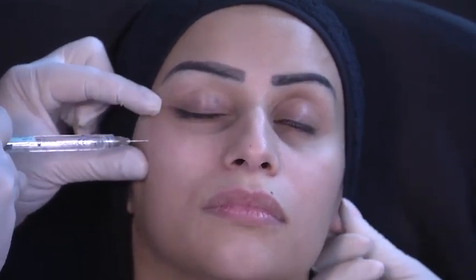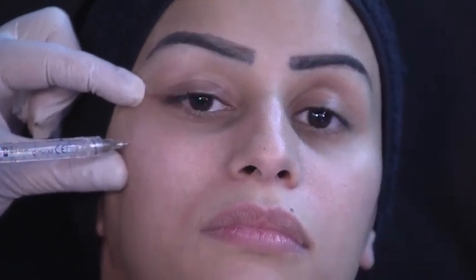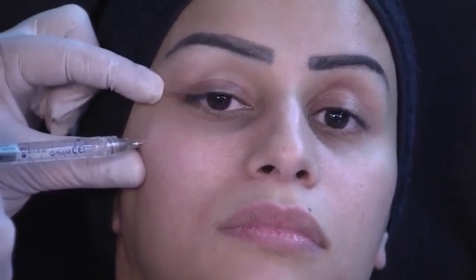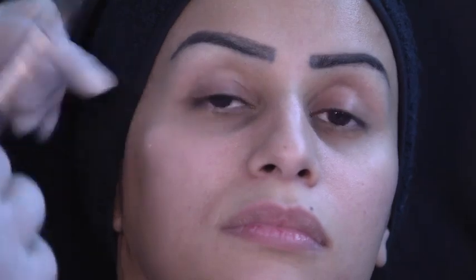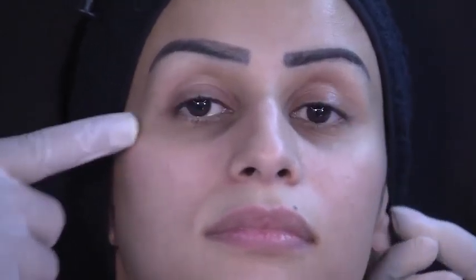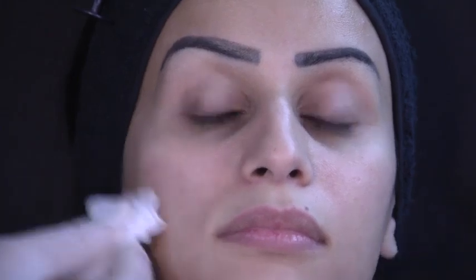So relax, look at the camera. We stretch the skin, completely perpendicular. I touch bone. I'm just going to do a 0.15 or 0.2. Very slowly. The speed of infiltration also plays a role. 0.2. That's it. Now look at this nodule. This is the ending point of my treatment. I need to see this exaggerated nodule, because just with one touch, still an OBT technology, now the exaggerated nodule has disappeared, but I still maintain the projection and the contour of the product.